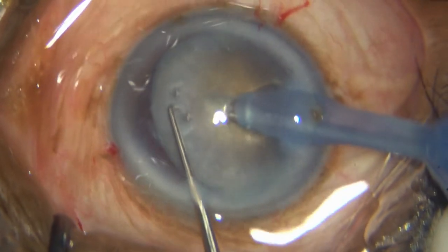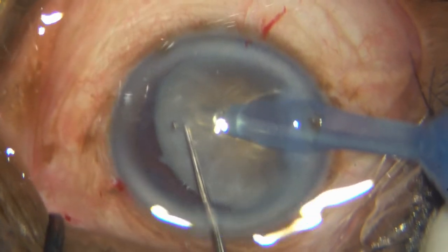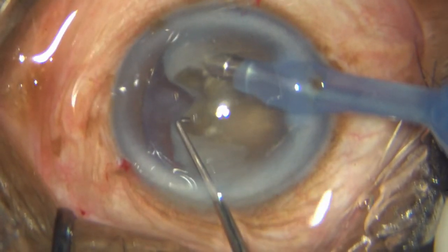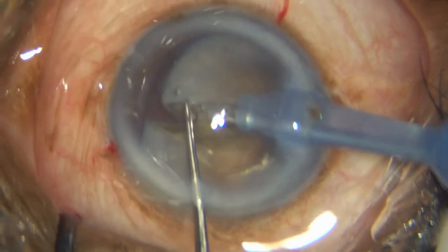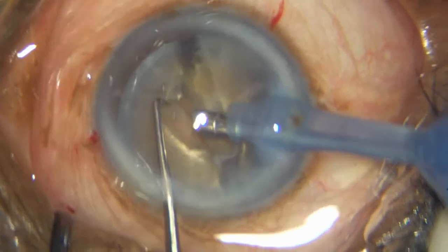So here I am going in the opposite direction. Again, chop. You can see those leathery fibers across. I am tearing it with the lateral separation just about enough, and now I target one hemi-nucleus.